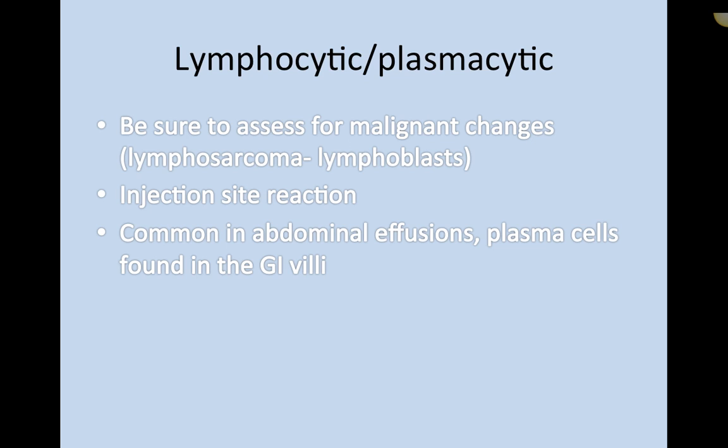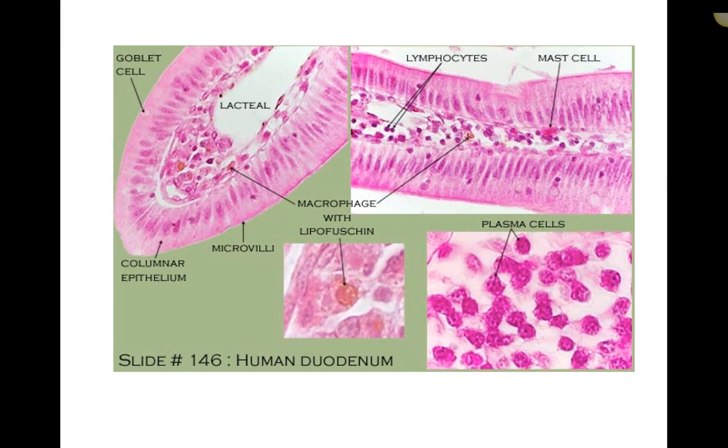We'll talk about that more when we talk about neoplasia, but never, ever let it escape your head: if you're seeing a lot of lymphocytes, and especially a lot of different lymphocytes or abnormal looking lymphocytes, or you're seeing lots of lymphocytes without seeing plasma cells, then always keep in the back of your head a lymphoma. Cutaneous lymphoma. And again, we don't diagnose it. It's just us giving the information to the vet or sending out our description with the cytology for it to go and be confirmed at the lab.